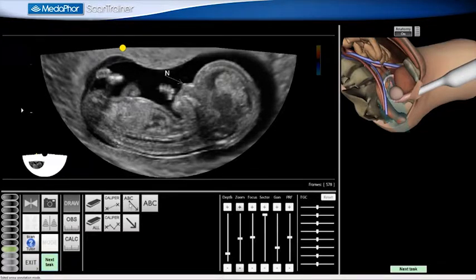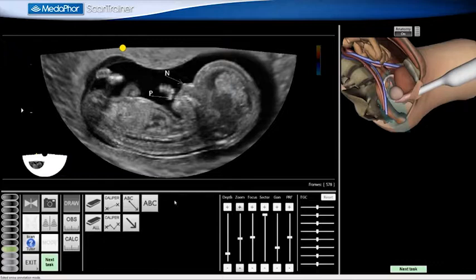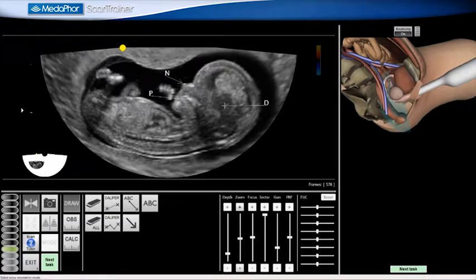I will now label the fetal palate using the ABC label tool. I then click Next. I now label the diencephalon. I then click Next.